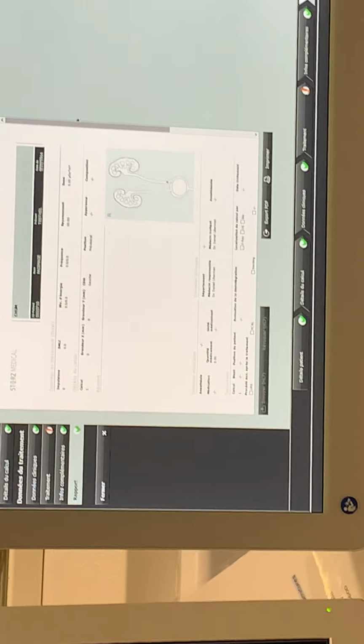You know, guys, I think we're gonna love the machine. I think so. The two guys, Dr. Leiberman and Dr. Bojani, are always like, "Oh my God, that's so nice! Oh, I love it!" We're in the 21st century. Yes, yes, we are.